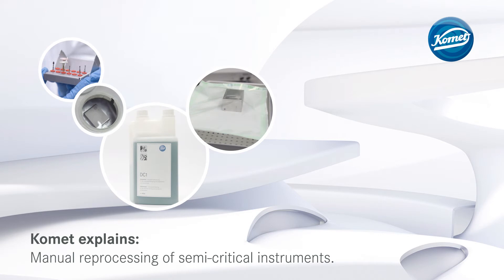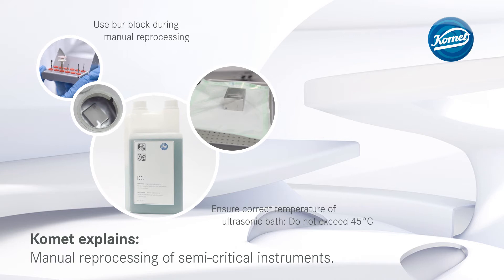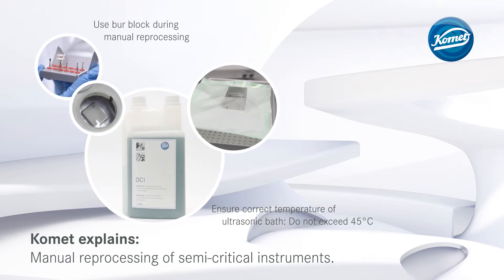That's how you do it. The instruments should be placed in a burr block during manual reprocessing. Ensure correct temperature of the ultrasonic bath — do not exceed 45 degrees Celsius.